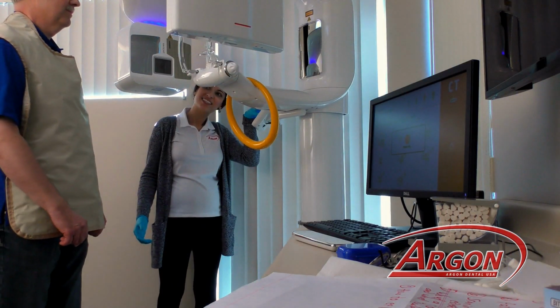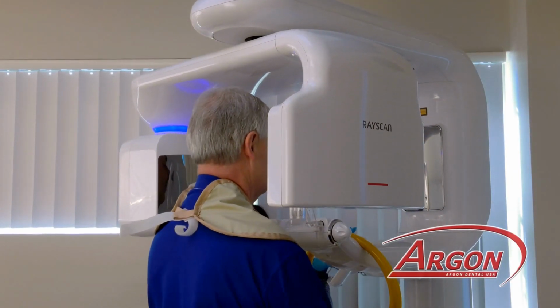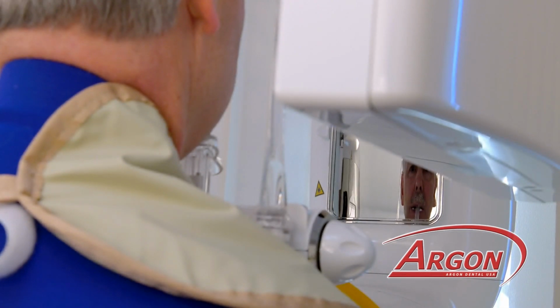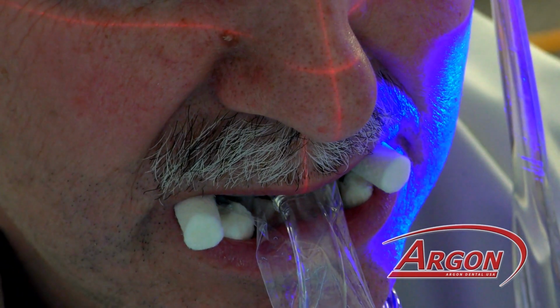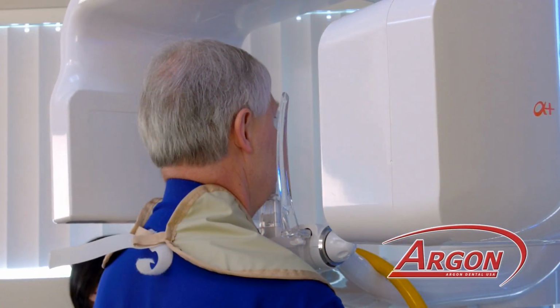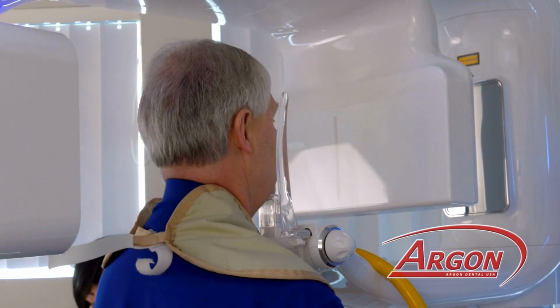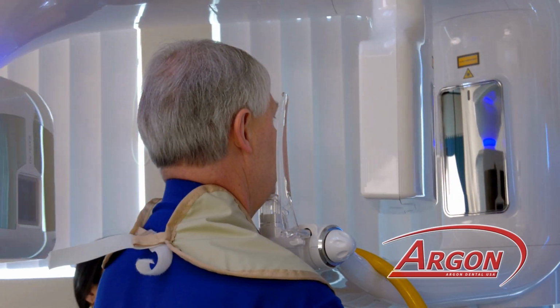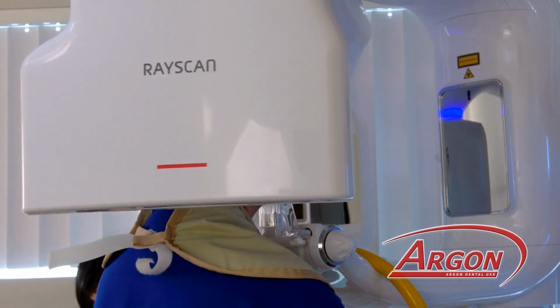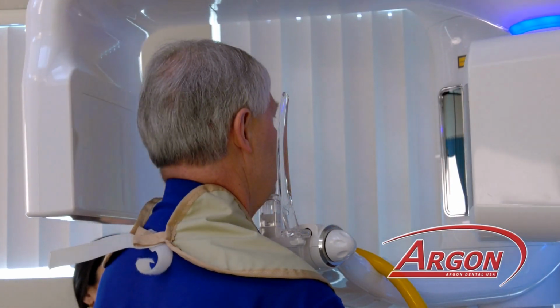Have the patient stand in and grab the yellow support arms. They would position on the chin rest, also using the bite stick as we did earlier, and take the CT scan. If the patient is positioned with their feet slightly forward of their shoulders with a slight lean back, holding the yellow bar, it does allow for better positioning, pulling the shoulders forward, which minimizes any hits from the sensor.